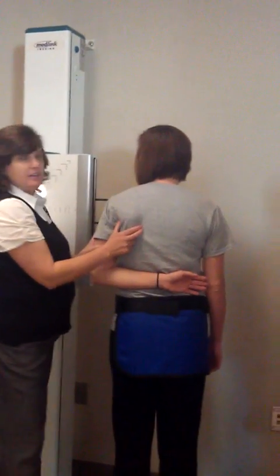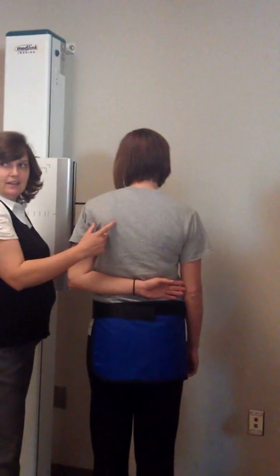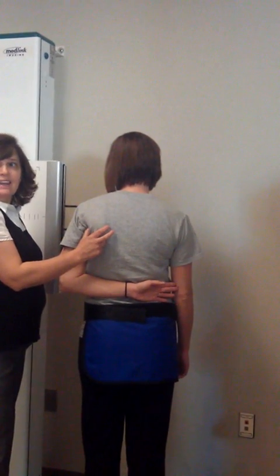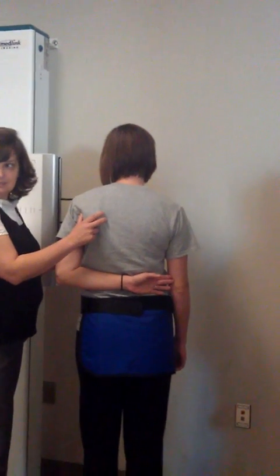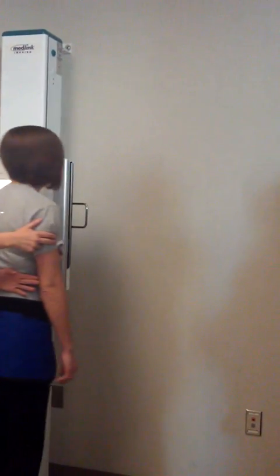Do you see how her scapula sits down there? So we're going to refine both borders — we're going to get that one. We're not paying attention to how oblique our patient becomes.